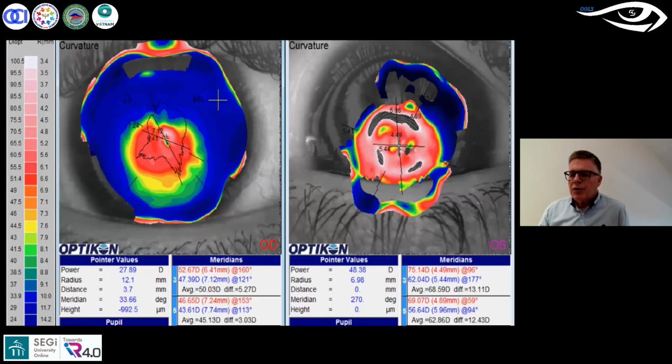Now, here's an image of a rather more advanced keratoconic patient. We can see the image on the left-hand side. This requires no explanation whatsoever. What's interesting about this image is we can see the Placido mires here are very, very spaced out. From keratoscopy alone, from my very, very basic tool, I can see that this is a very flat zone here.